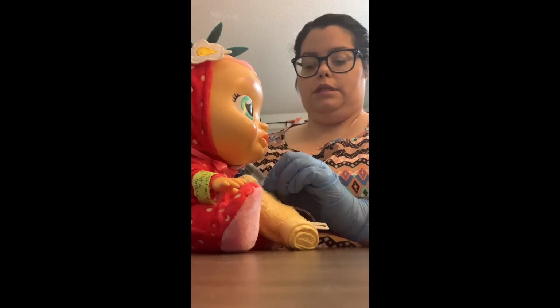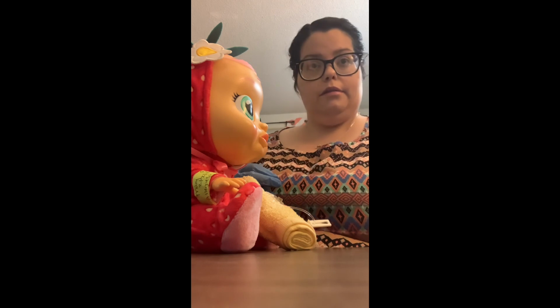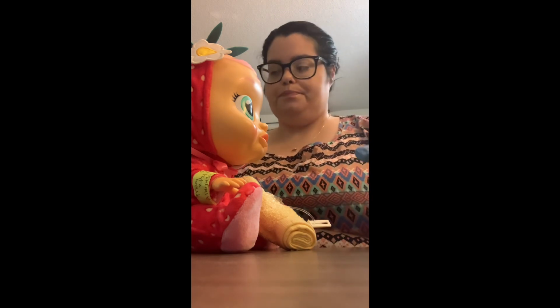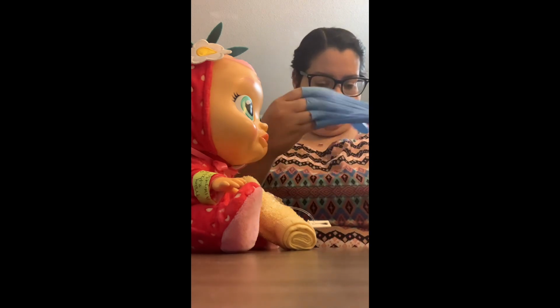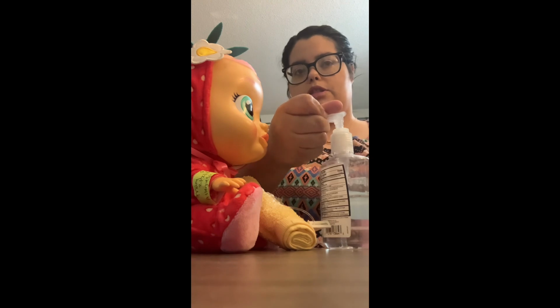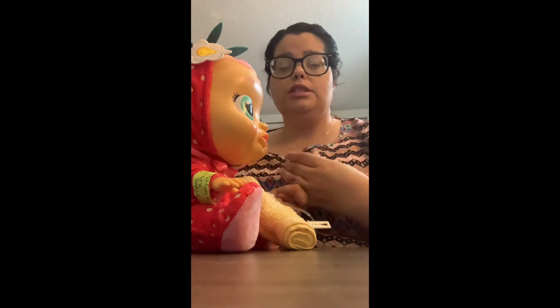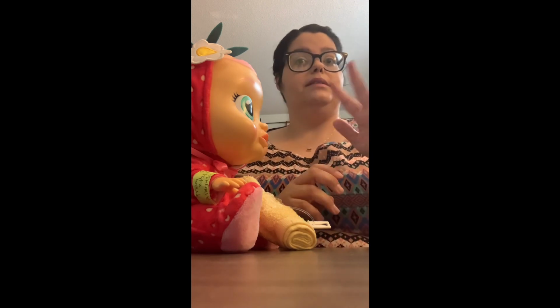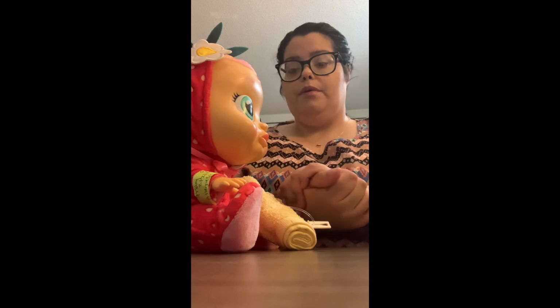Now we can proceed on disconnecting, discarding the other saline flush, removing our gloves, washing our hands. We always want to answer any of our patients' questions, as well as leaving them in a safe, secure position, and always with the call bell within reach.